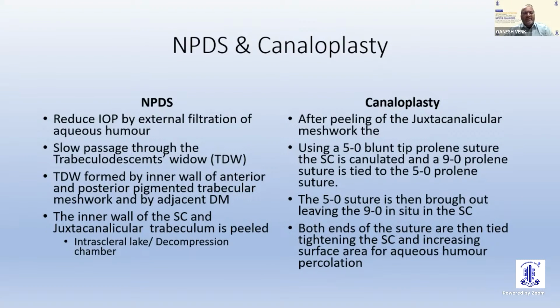And you do this by generating a trabecular Descemet's window. So through that window, the aqueous humor percolates through the inner wall of Schlemm's canal, and you form an intrascleral lake, something like a decompression chamber.